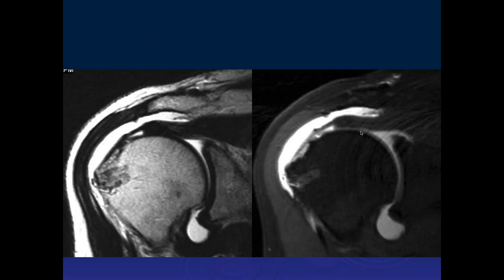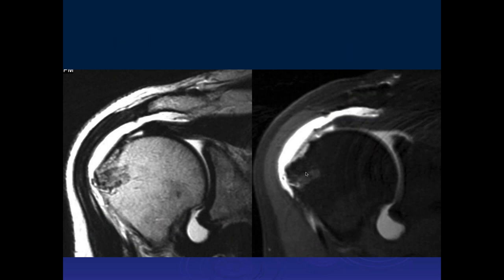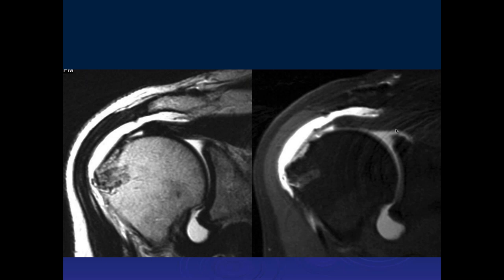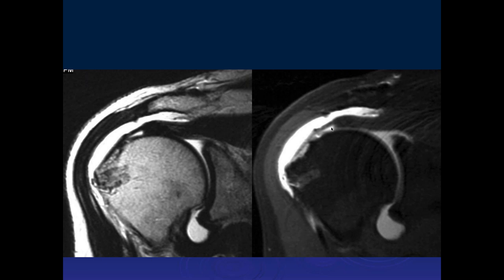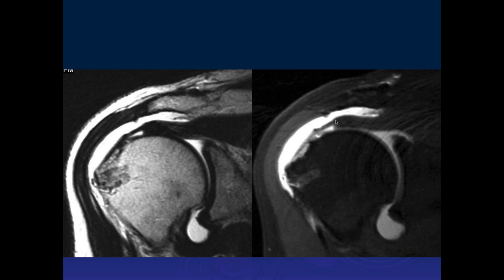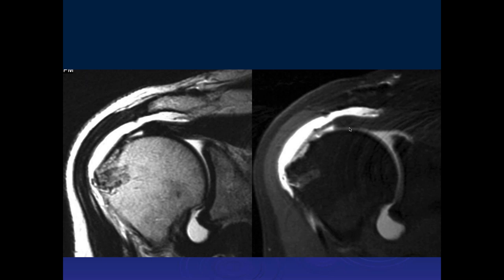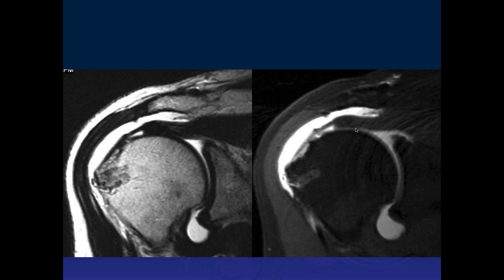What we see here is a patient who had a repair of the supraspinatus tendon. Notice that the musculotendinous junction is retracted — it's supposed to be around the 12 o'clock position, but it's retracted all the way back to the glenoid. This is the distal end of the supraspinatus tendon; the construct has torn. We see a black line continuing from the tendon down to where the suture anchor is placed — this is called scar in situ. You can actually have tears of the supraspinatus tendon that scar over, resulting in a significant rotator cuff tear without communication between the joint space and the subacromial-subdeltoid bursa. So you can have significant rotator cuff tears without a positive arthrogram, which is why MR is really important in evaluating these.